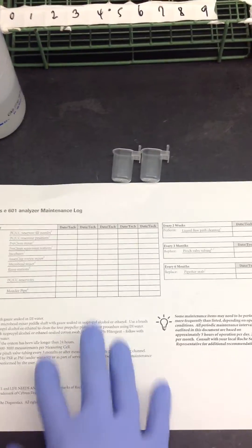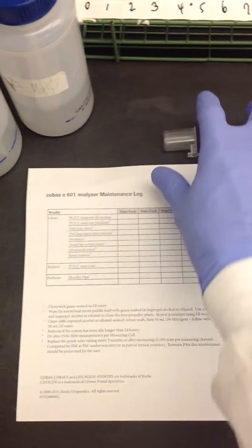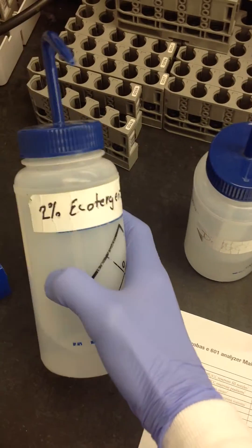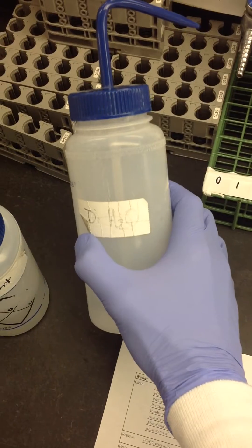There are a couple things you need for the weekly maintenance. For the 601 side, you need to have PCCC reservoirs — you need two of them. You also need 2% Ecoturge, and you are going to need some DI water.